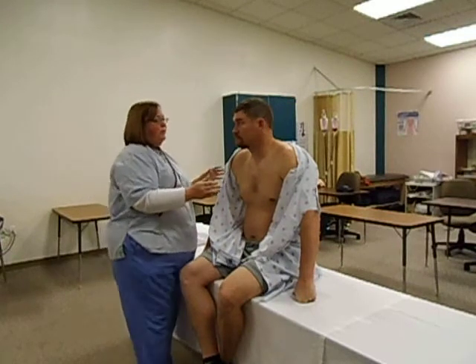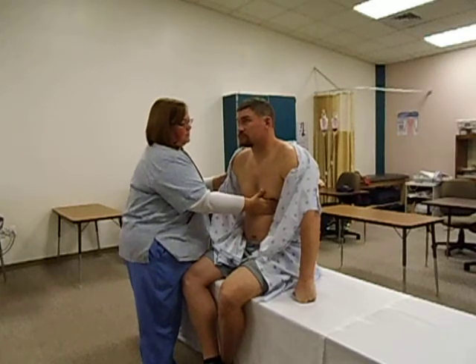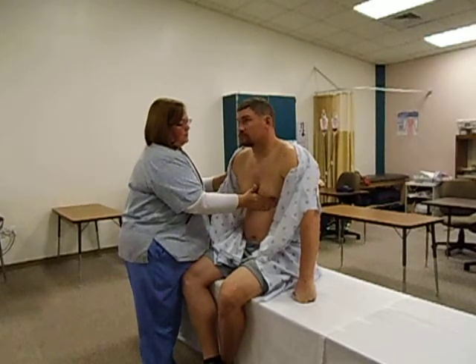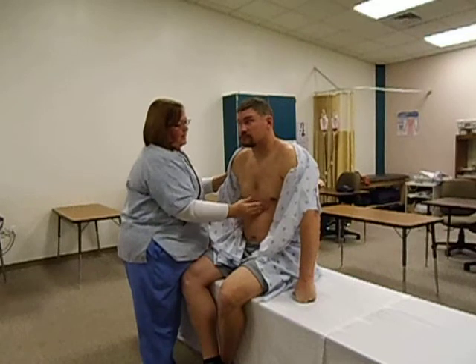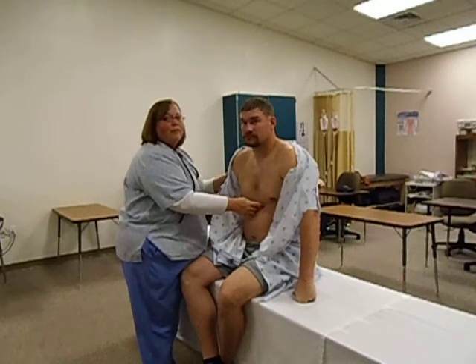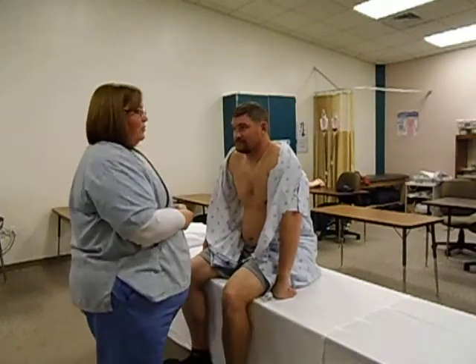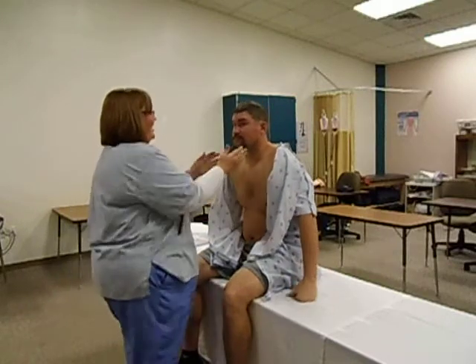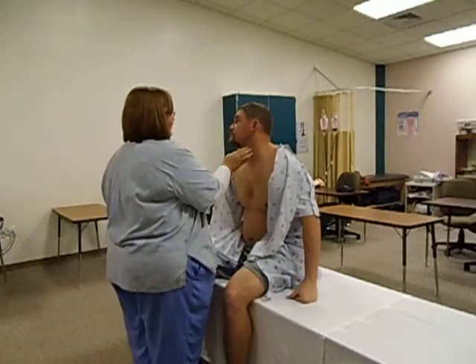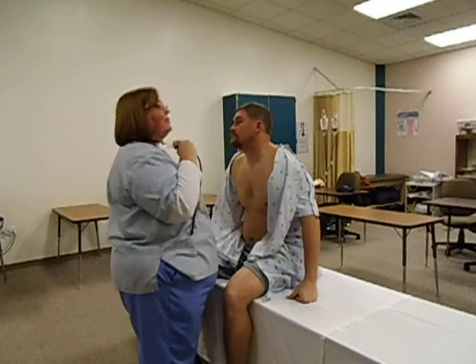I'm going to feel for the apical impulse. The apical impulse is noted to be right here. Now I'm going to palpate and auscultate the carotid arteries. If you will turn your head slightly. And this will be done with the bell of the stethoscope.